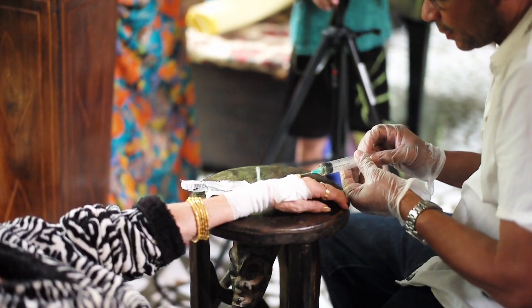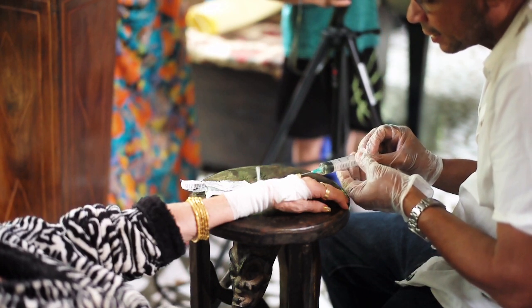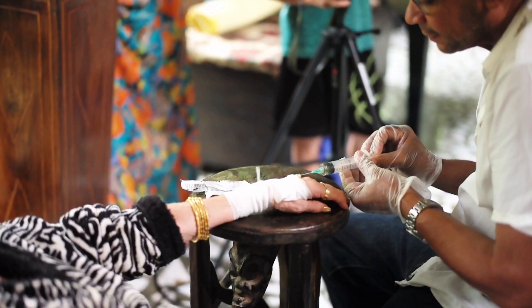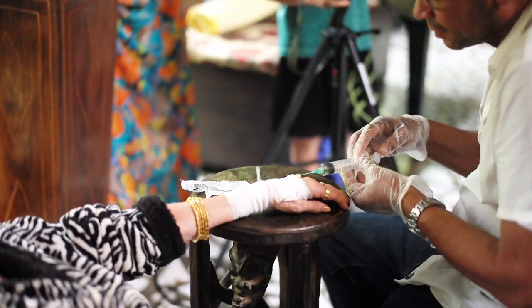Once I have it in, I'm going to draw back the plunger a little bit until I see a little bit of fluid coming in. Okay, saw a little bit of blood. I'm going to slowly, over the next 5 minutes, push the plunger in. Well, the plunger is all the way in, the medication has been administered. Carefully remove the syringe, put the cover back on, and discard that. And now we're going to cover the catheter back up, keep it clean, wipe it up.